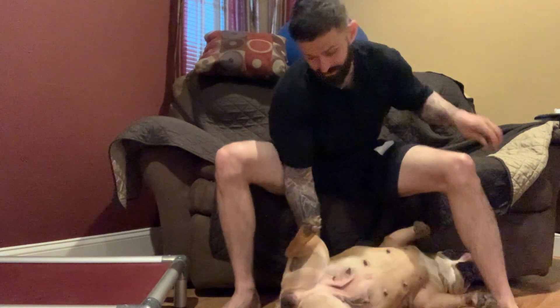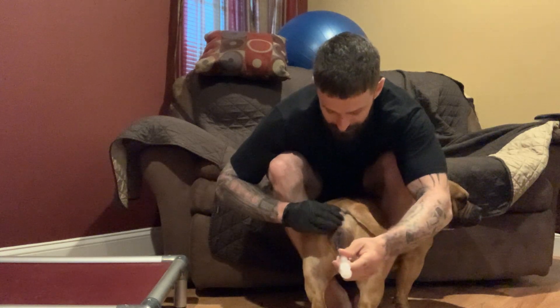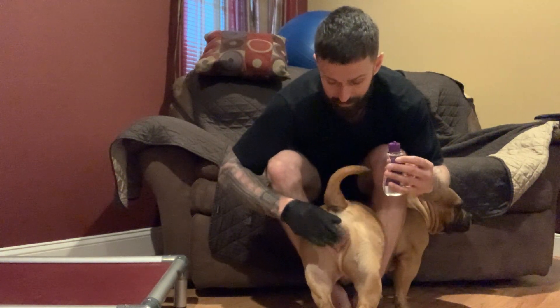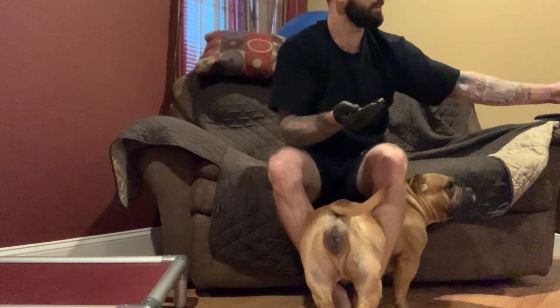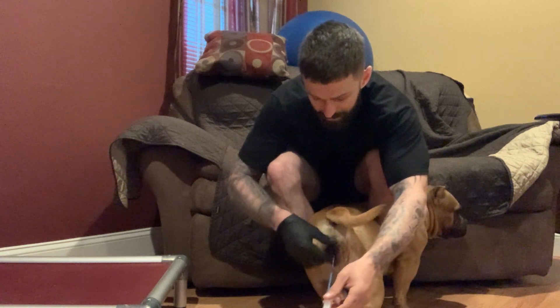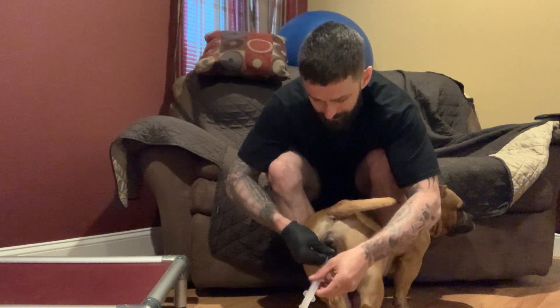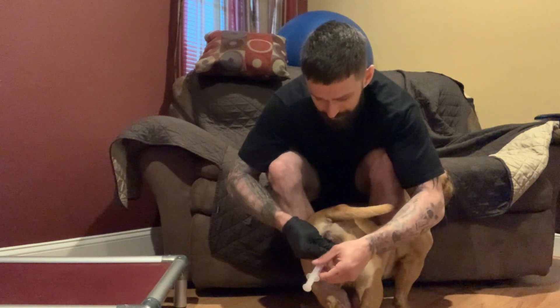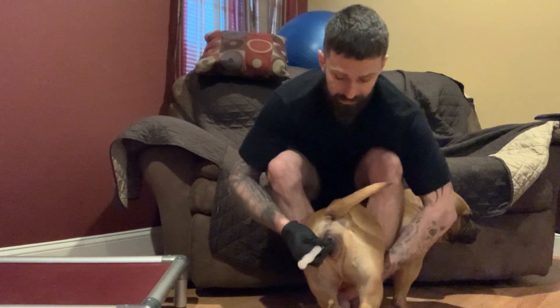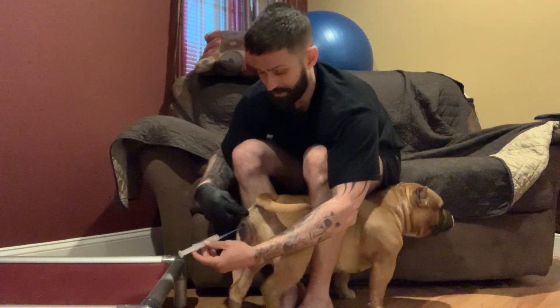She doesn't like it. She's like, 'You're gonna twist me again.' Alright, basically you get them ready. Almost forgot — gotta do some lube. Lube this bad boy up and lube that too. And it simply just goes in.